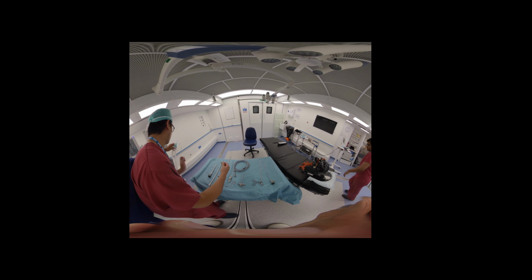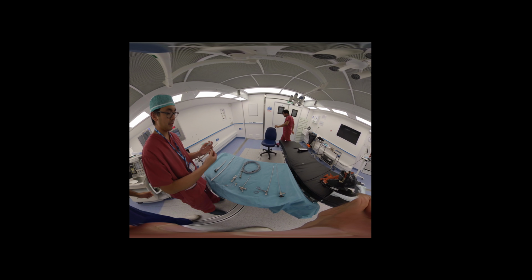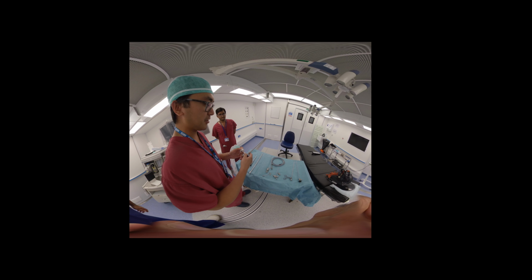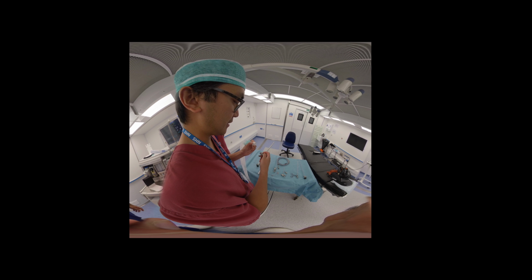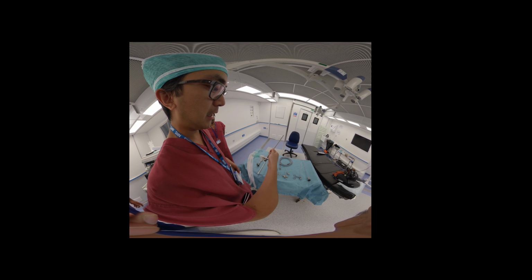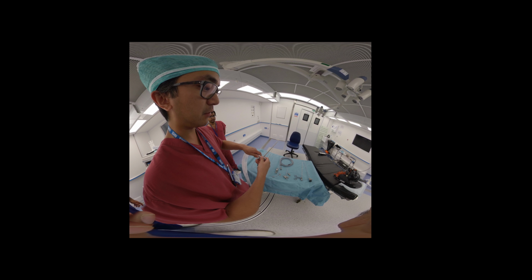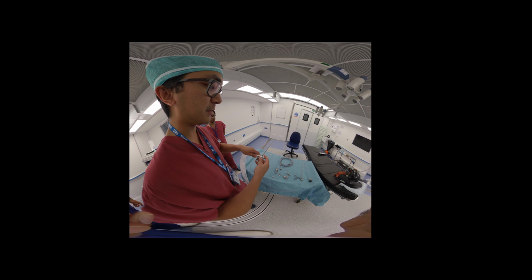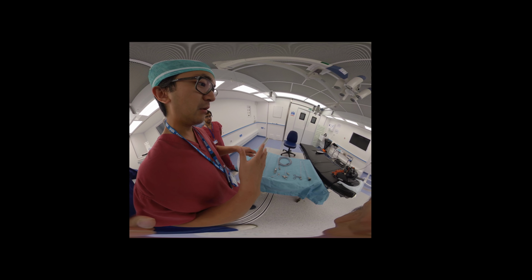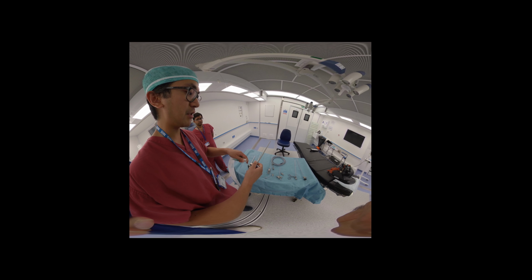Okay, so yeah. So this will be the anaesthetic circuit, okay, and the anaesthetist will set this up. This is essentially the last thing you attach, so you can attach the anaesthetic circuit to the left side here, and that fits on basically onto all of these bronchoscopes. That is essentially the last step you do before you insert the bronchoscope. So we'll show you how to set up the bronchoscope and arrange it first.